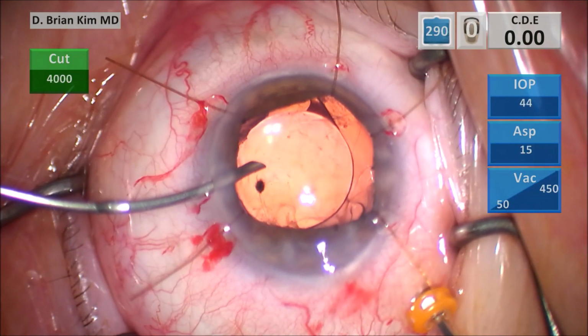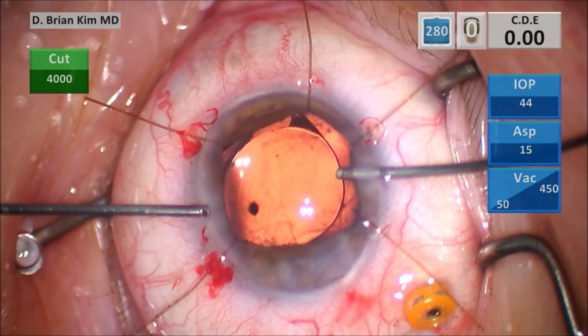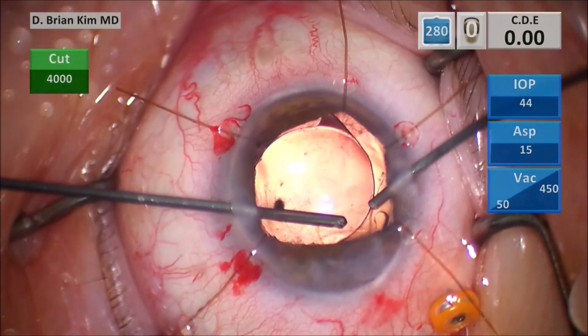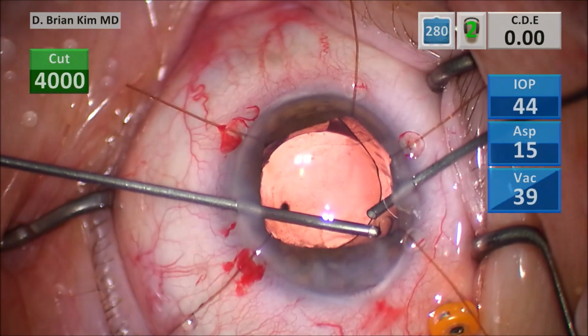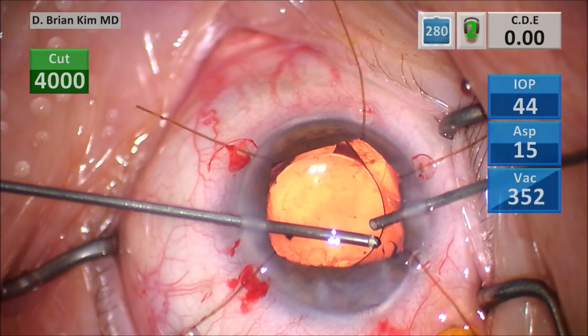So those are the two things. That's when you know you really need to do something. That the lens IOL is actually shifting anteriorly and was decentering away from that defect. And that's because of that volume coming through. So I went ahead and placed the pars plana trocar.